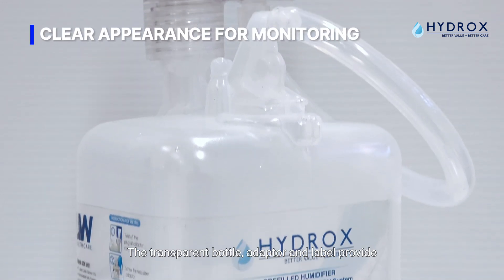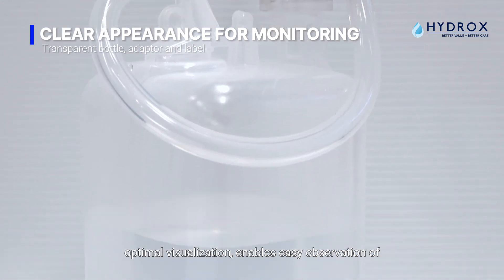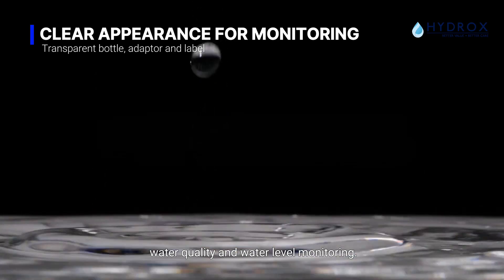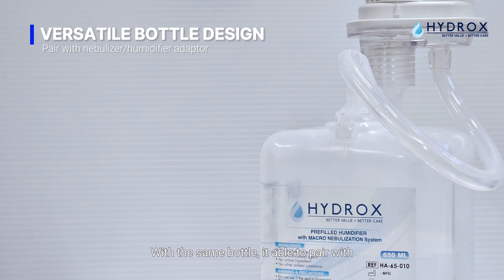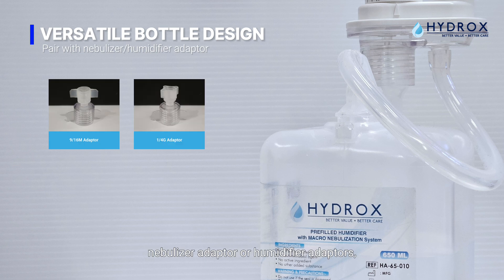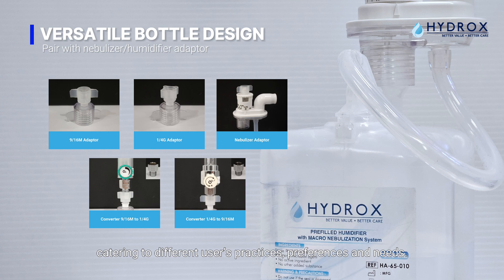The transparent bottle, adapter, and label provide optimal visualization, enabling easy observation of water quality and water level monitoring. With the same bottle, it is able to pair with a nebulizer adapter or humidifier adapter, catering to different users' practices, preferences, and needs.